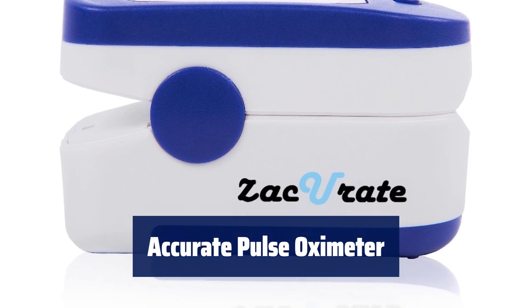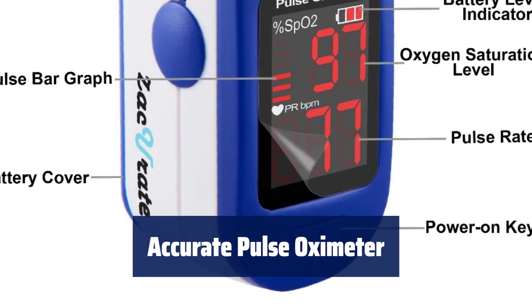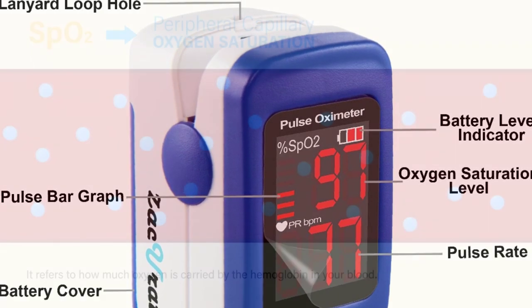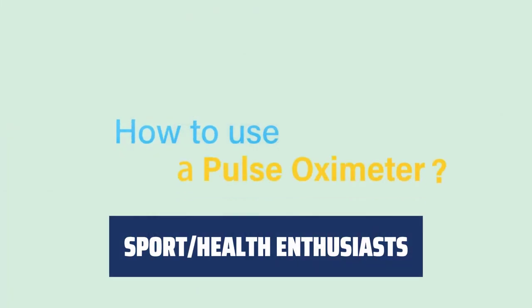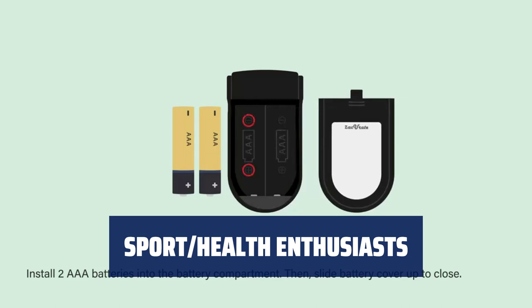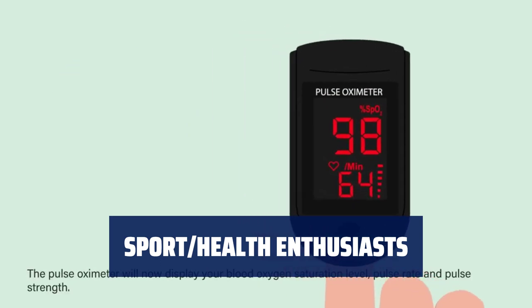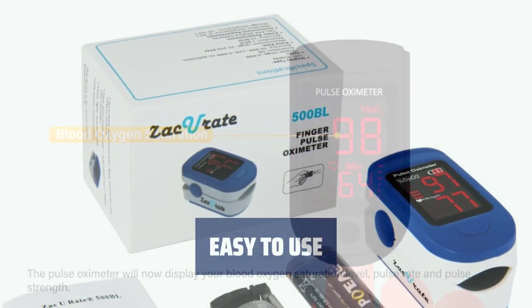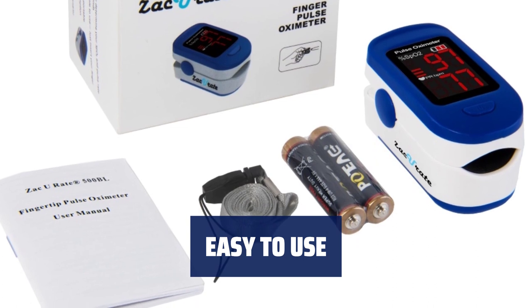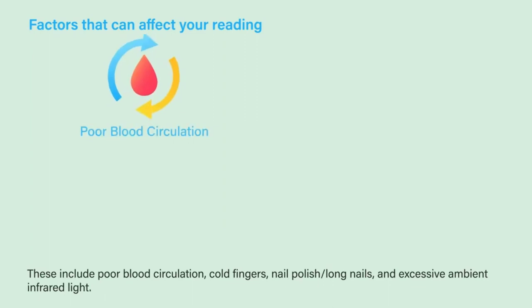Number 4. Accurately determine your blood oxygen saturation levels, pulse rate, and pulse strength in just 10 seconds. The results are displayed conveniently on a large digital LED display. For sports enthusiasts like mountain climbers, skiers, hikers, or anyone interested in measuring their SpO2 and pulse rate, the device now faces towards the user for easy reading. Taking a reading is simple — just clip it onto your finger and turn it on with the press of a button.